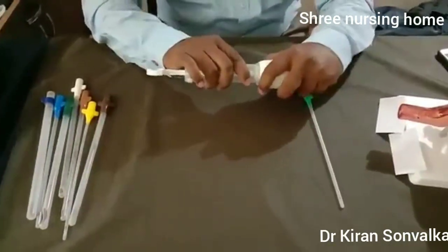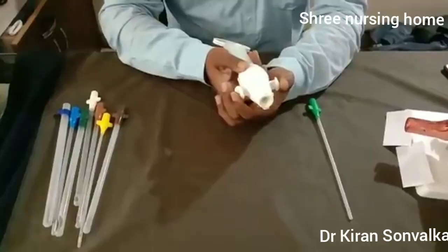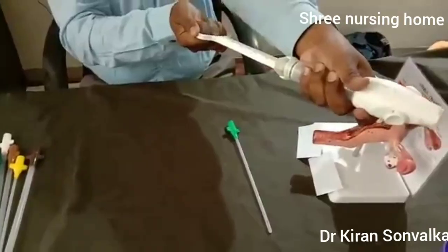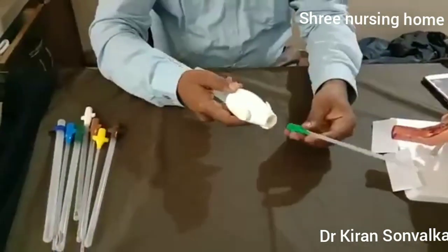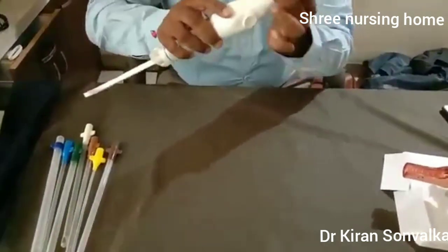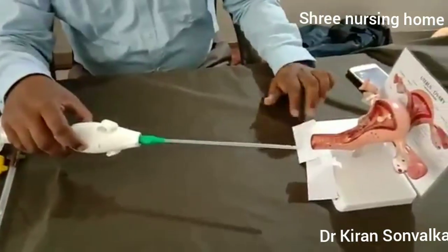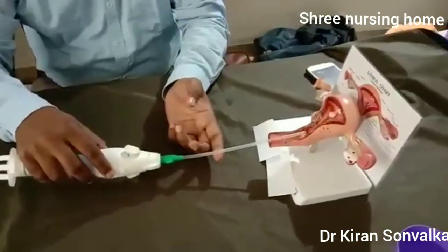Then you have to lock the valve by pressing the valve button. Then pull the plunger — you will get some resistance — and lock it. Then put the desired suction cannula on the tip of the MVA syringe.